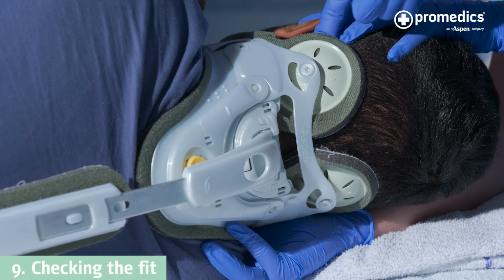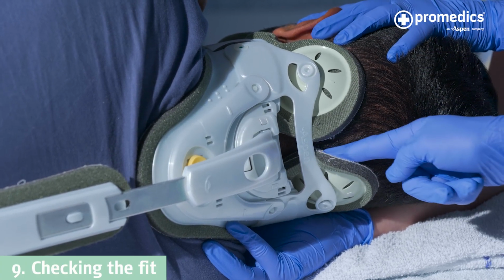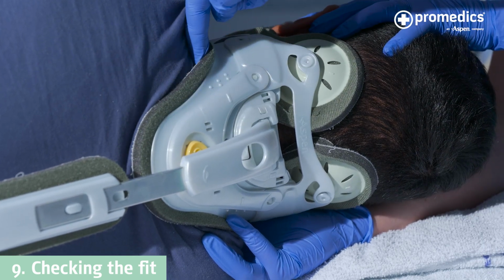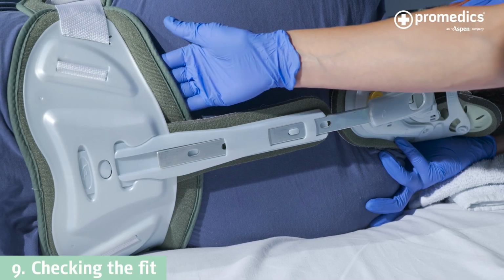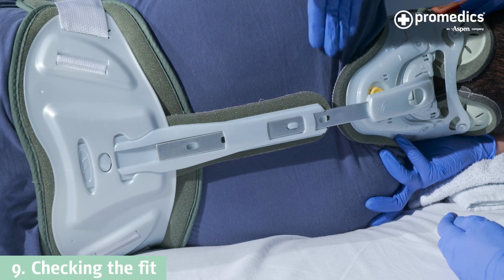Run your finger around the occipital pads and ensure they are flush to the skin. Check that all foam is overlapping plastic and that the brace is firmly applied.